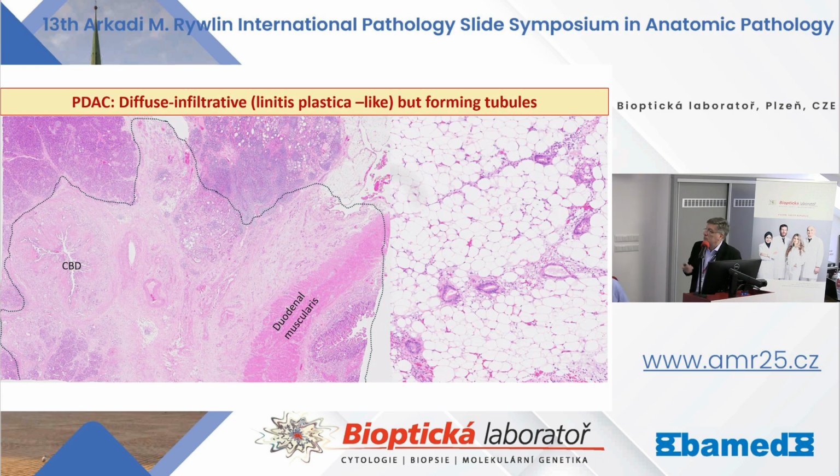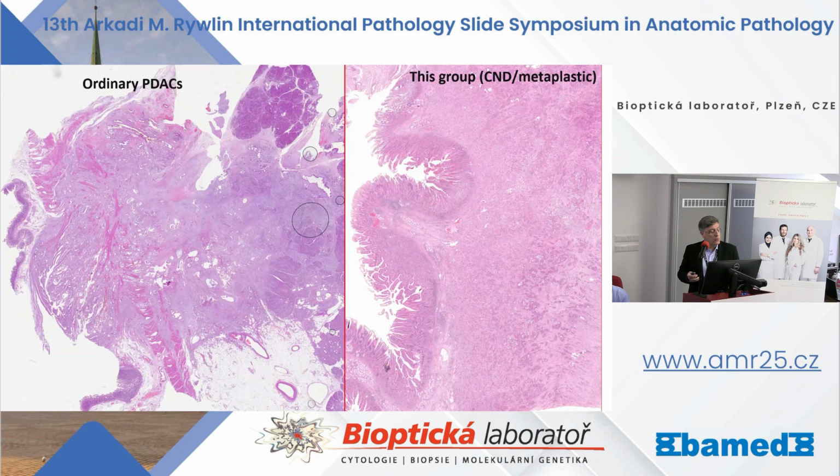And when they infiltrate to the adipose tissue, because they cannot form compact nodules, you see these separated individual tubules that almost look like embryologic remnants if they're so well differentiated. So in other words, the picture on the left shows what our ordinary PDACs typically do. They infiltrate, they may preserve the tissues, and they don't stop somewhere. They just keep going, whatever is in front of them.